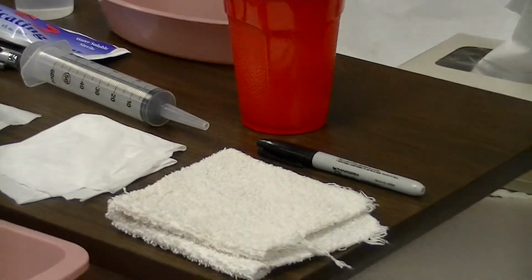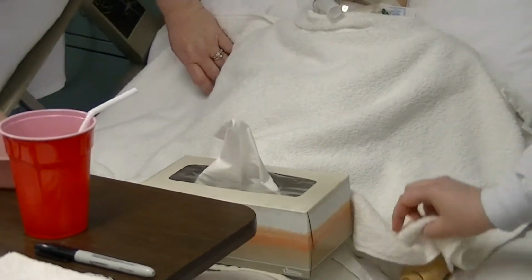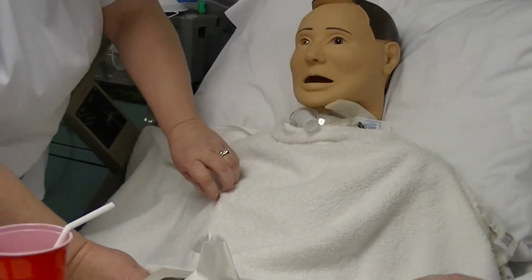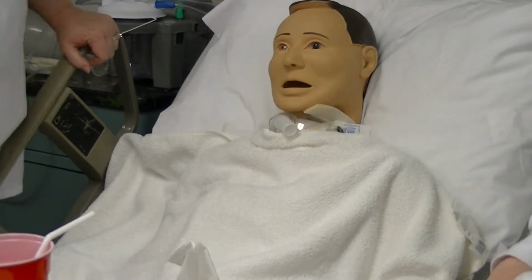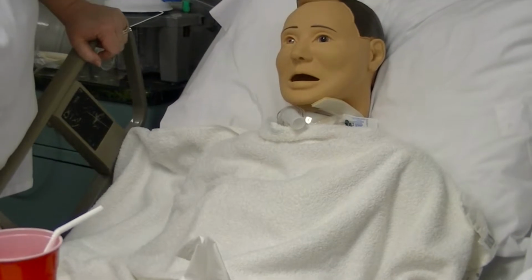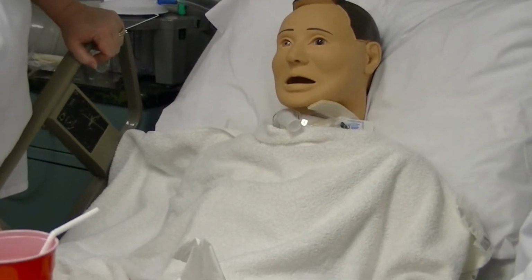The nurse is going to identify herself. I'm Tamara. I'm going to be your nurse today. And identify her patient. Can you tell me what your name and date of birth is? My name's Mr. Jones, 31053.